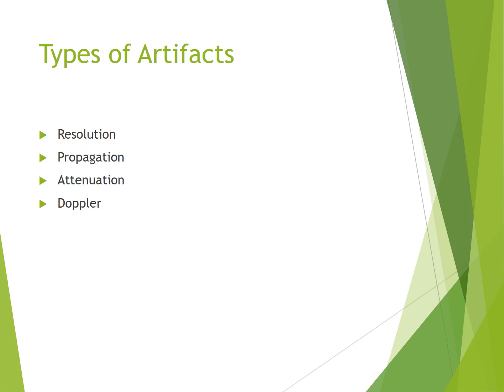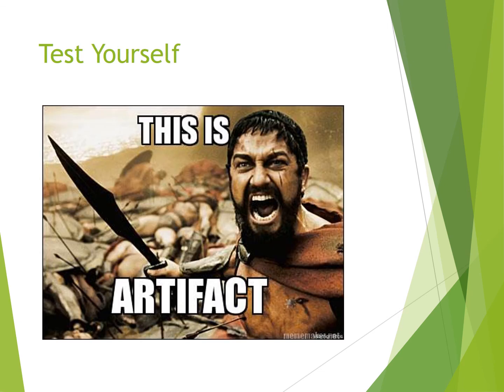The next 4 videos that we're going to talk about break down artifacts into their types. So we have resolution artifacts, propagation artifacts, attenuation artifacts, and Doppler artifacts. All of those will be covered in their own video lectures.